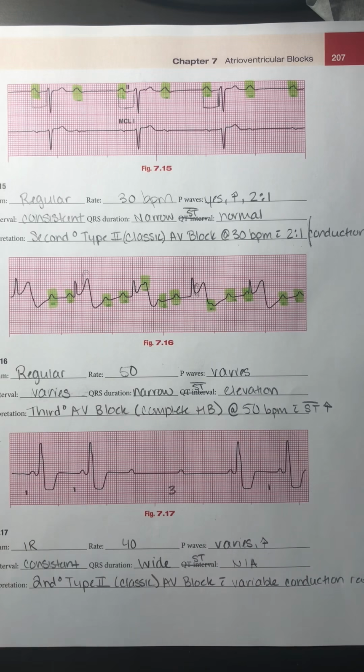They're just on 2 totally different paths. So my atria is beating at a regular rate, and my ventricles are beating at a regular rate. There's just no connection, no communication between the atria and the ventricle. So we call it a complete heart block. If the P's and Q's don't agree, then you have a third degree.